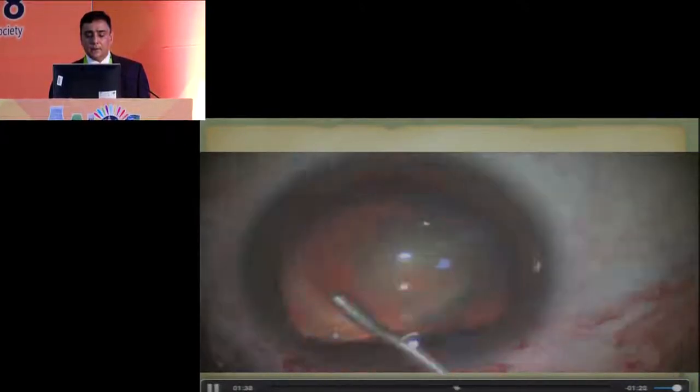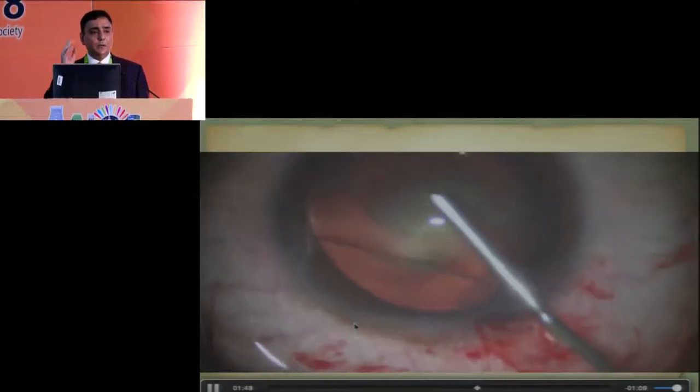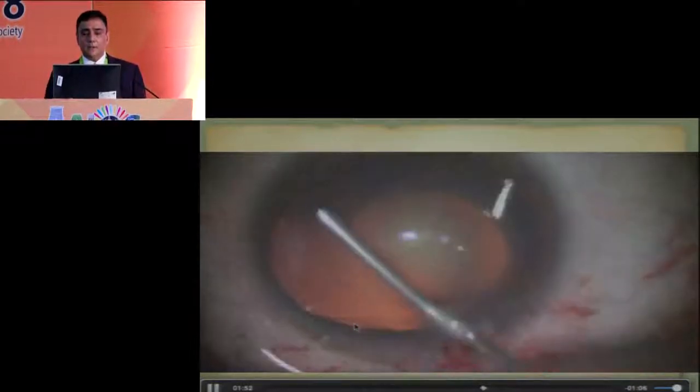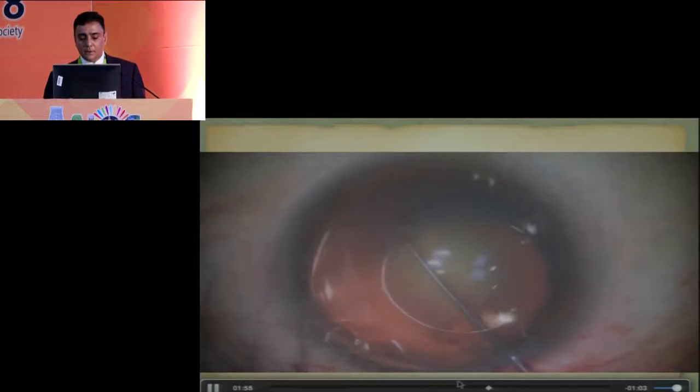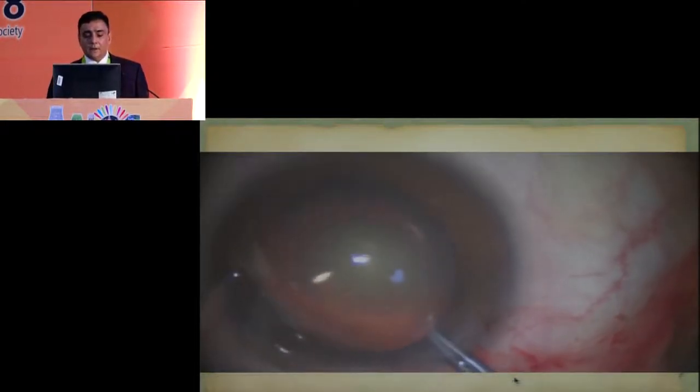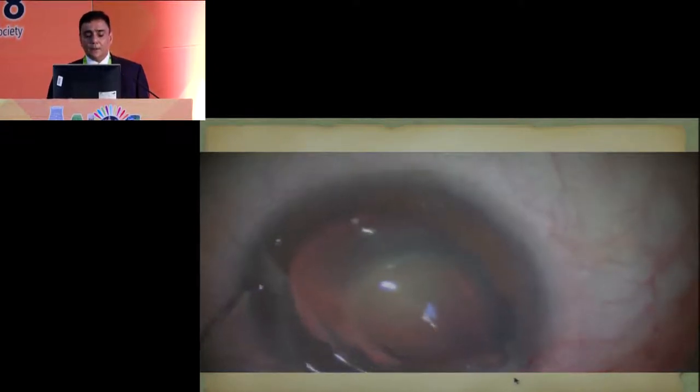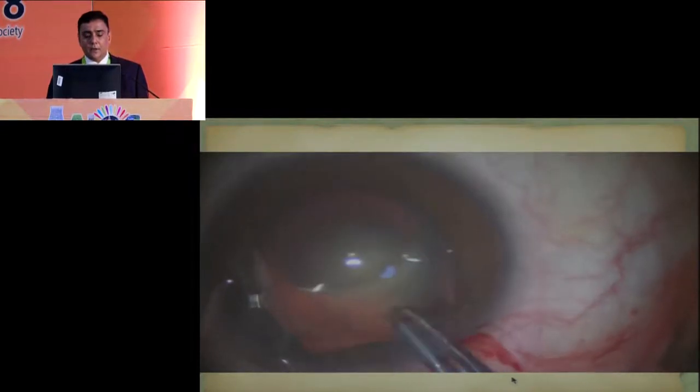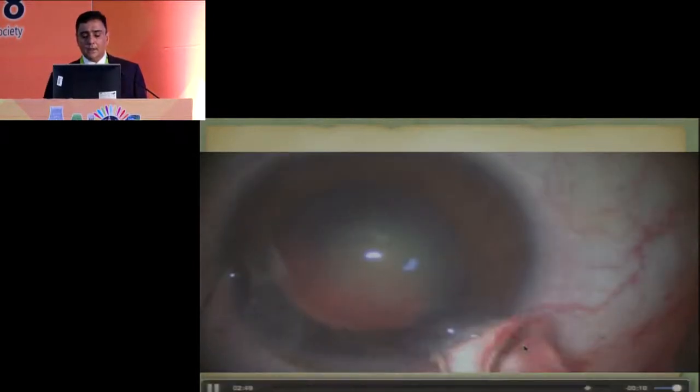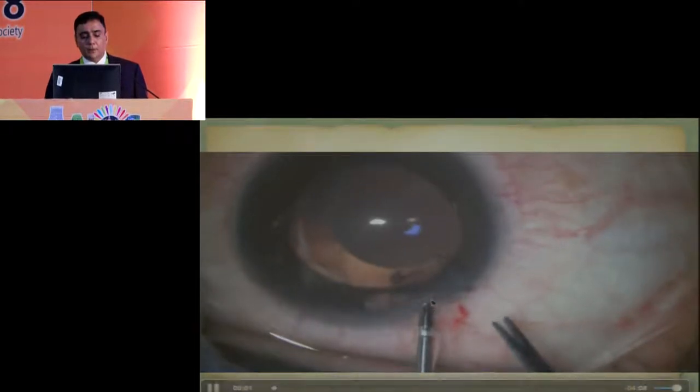When removing the ICL, bring it into the anterior chamber, rotate in the direction of your incision. For IOL calculation when the ICL is in position, it really doesn't matter — do your optical biometry, do your calculation, remove the ICL, and proceed with phacoemulsification and place the lens. Make the ICL horizontal, hold it with the forceps, and bring it out through a 3.2 mm incision. If it slips back, don't worry — go back in, hold it, and pull the whole ICL out. It's as easy as that.